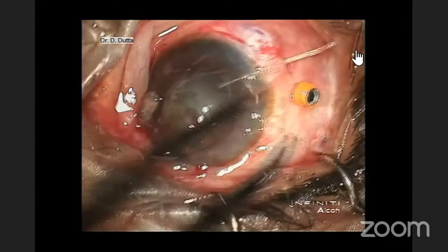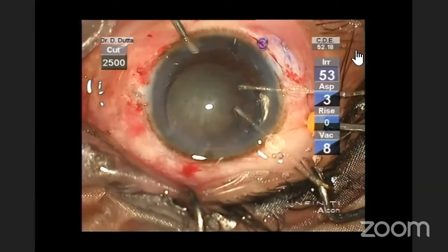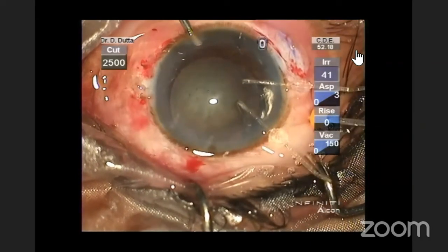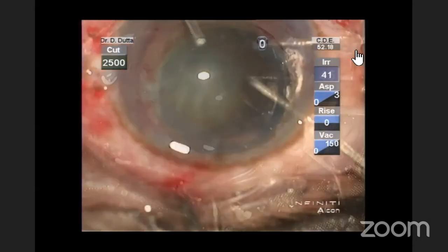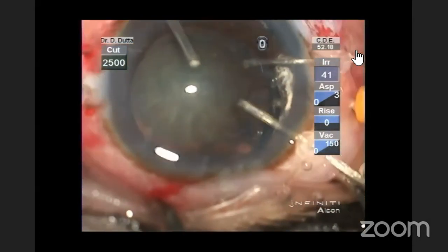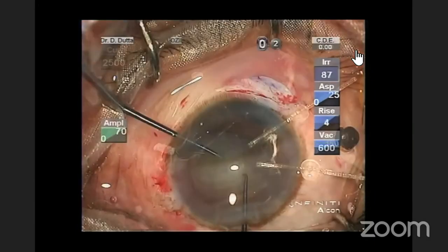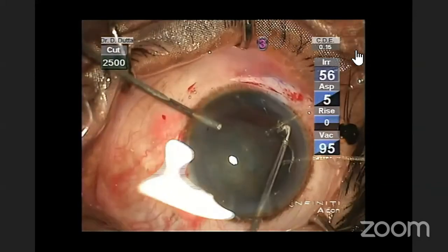Anterior vitrectomy is done through the pars plana with the cutting port facing the optic disc, lest it injure the still intact capsular bag. Irrigation is maintained in the anterior chamber. This keeps any more vitreous prolapse at bay. Hydrodissection and careful bimanual rotation of the nucleus is attempted. Vitreous is removed from the anterior chamber also.